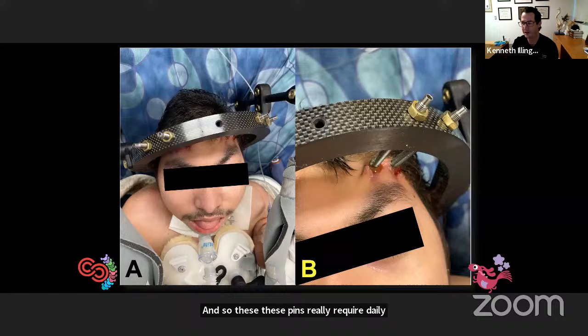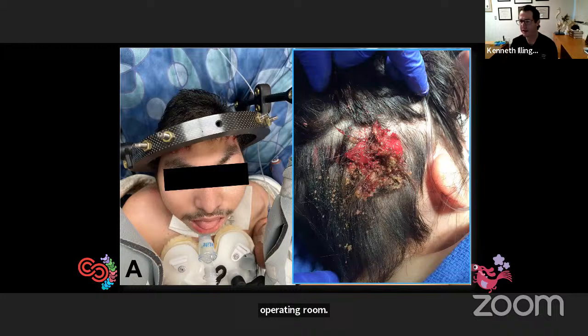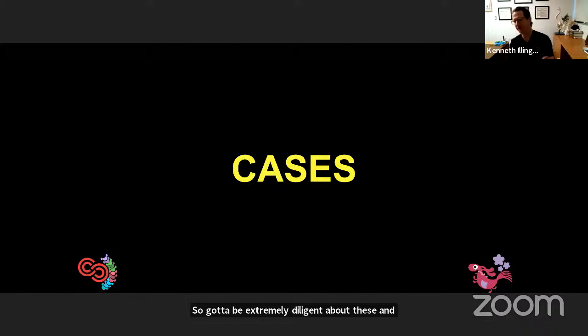There's another example of a pin site infection. Anytime you get pin site infections, it loosens the pin. If you loosen the pin, you can get pin migration. You can see this particular patient had both pin site infection as well as early signs of pin loosening and pin migration, and required revision of his halo in the operating room. Here's another example of just a pin site infection from a halo vest immobilization. So you've got to be extremely diligent about these and do really close monitoring to make sure that these are treated appropriately.